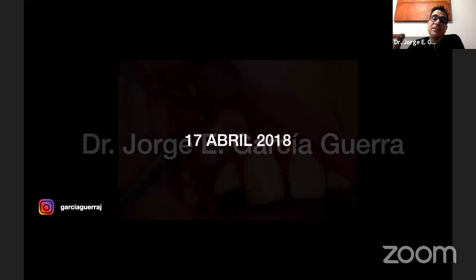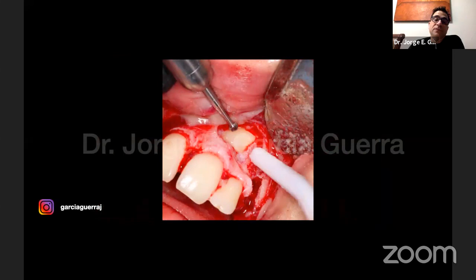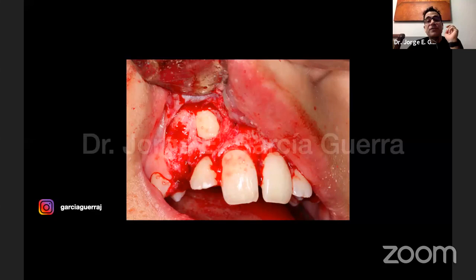Now, this is 2 years ago. This is the picture of the flap. The most important thing here is to take a lot of bone out of there, and this is what Dr. Chang shows us with a burr. We're starting to take off all of the bone around the crown of the tooth. You have to take all the cortical bone towards the eruption site.